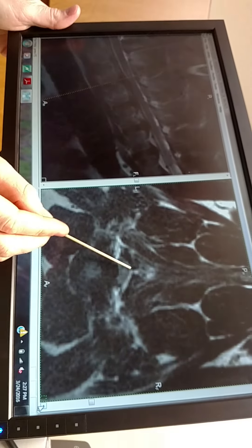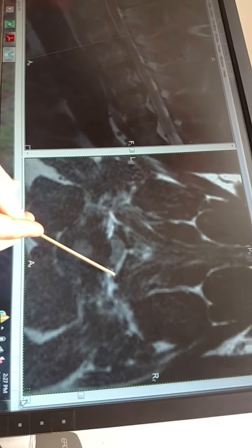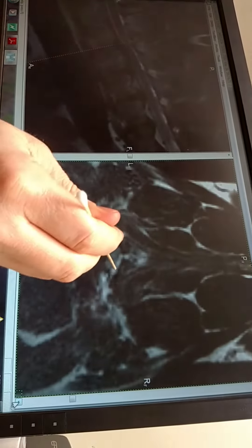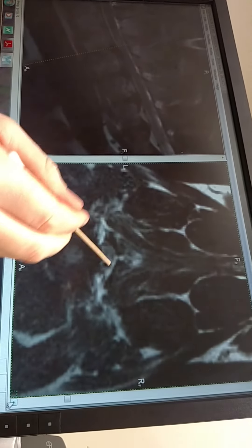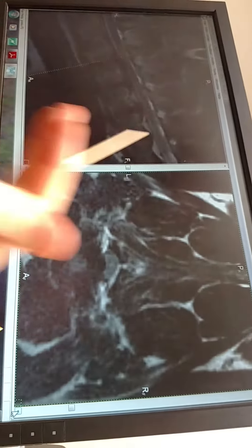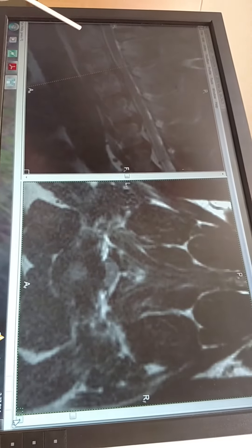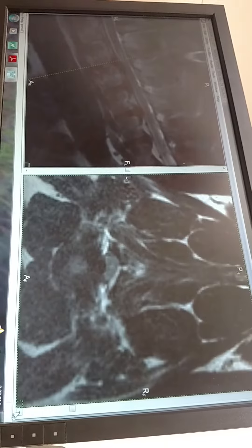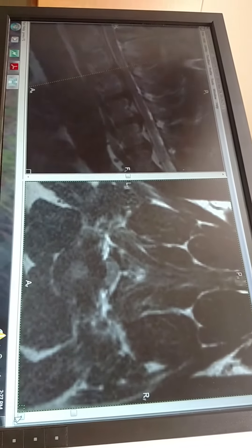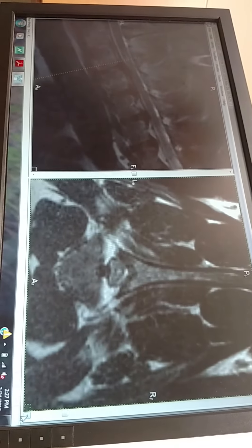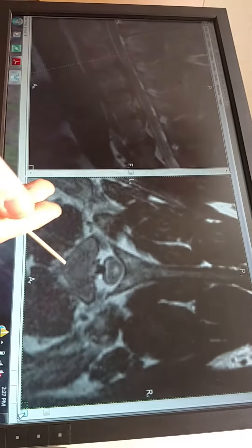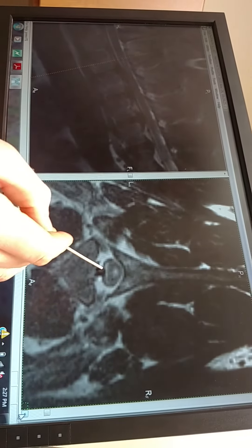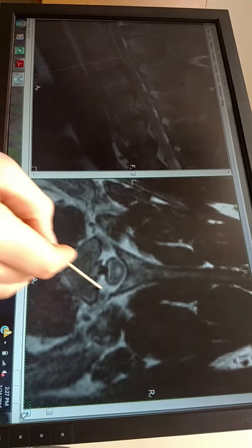In addition, you see this white streak right here? That white streak is a collection of fluid. I don't know if that fluid is in the joint here or in the spinal fluid there — it's very difficult to determine because they're right next to one another. My guess is it's spinal fluid right there. And now as we get past it, we start to go back to normal. Look at how much bigger the spinal cord is, how much smaller the disc is, and how much more fat there is.